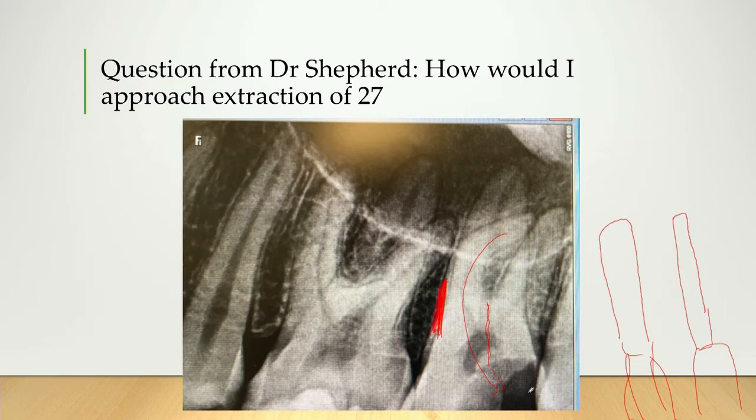I think, people put a bad name on luxators because in university you're taught luxators are dangerous, don't touch them. It's really, really dangerous. Yes, it's dangerous if somehow you pushed the luxator straight through and pushed the root into the sinus, or you slipped and ended up hurting the patient in the palate or something like that.